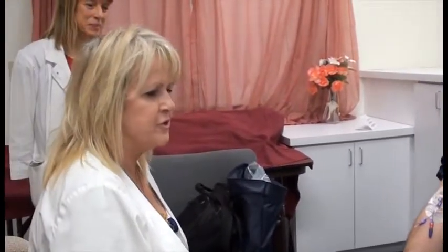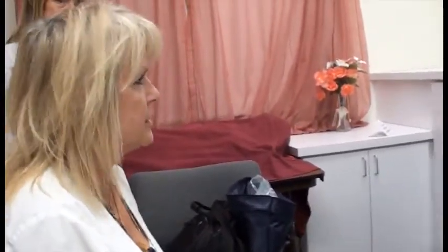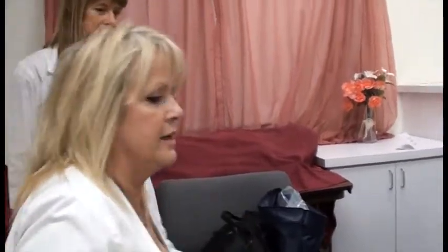So what we're going to do is, I know the nurse was here and she changed the dressing on your PICC yesterday, so it's just basically going to be drawing the labs, okay? Now, I've already washed my hands and sang happy birthday and all that, so the hand washing's all done, and I'm just going to come in and we'll get that taken care of, okay?